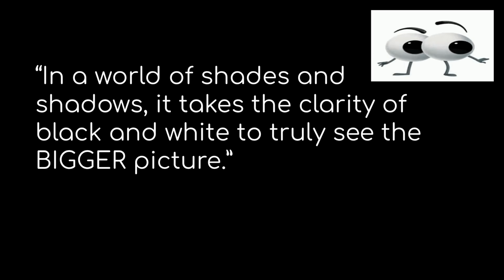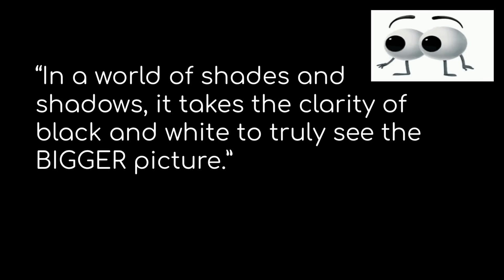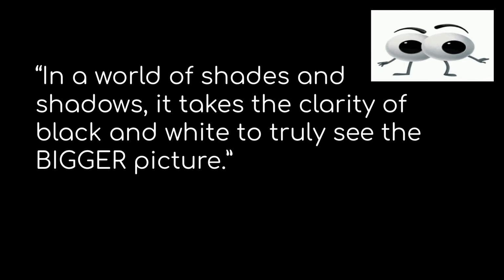As we explore these structures, remember that, in a world of shades and shadows, it takes the clarity of black and white to truly see the bigger picture.